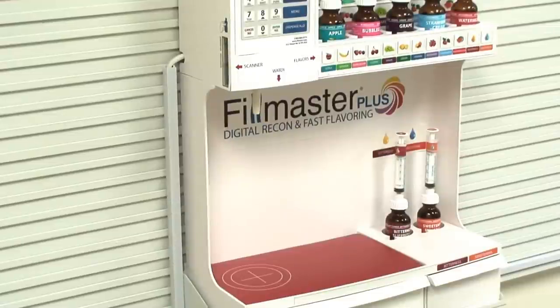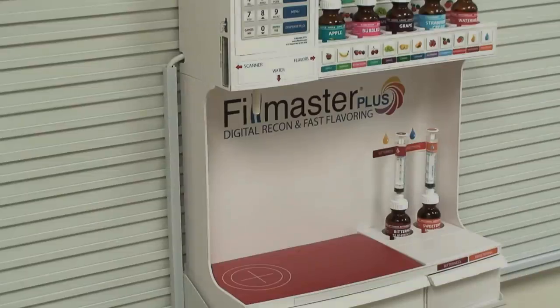Since space is at a premium in most pharmacies, we've designed the Filmaster Plus to include a workspace for you and your team. This area provides ample room for reconstitution and flavoring and is easy to clean.